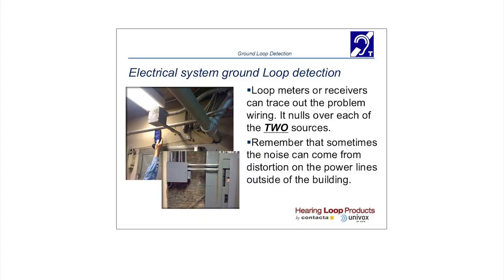Electrical systems, and I'm going to sidestep the slide just one second. There's a term out there called ground loops. And I want to say that term is amazingly used to cover a number of different things. For some of you, you may even hear a slight hum in the audio system. I don't know if that's showing up in the loop or not. Sometimes it does.